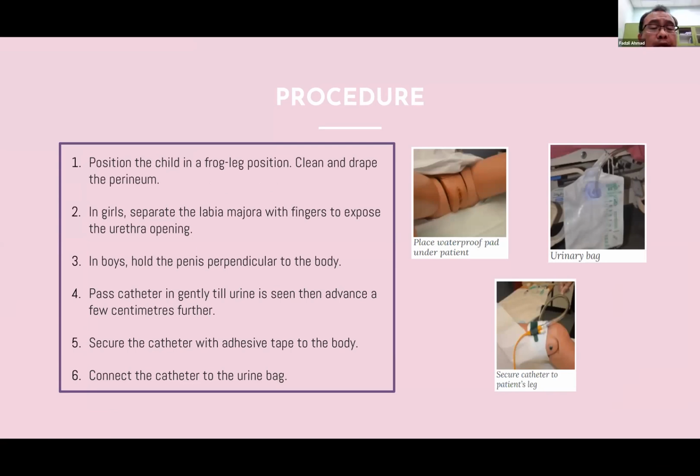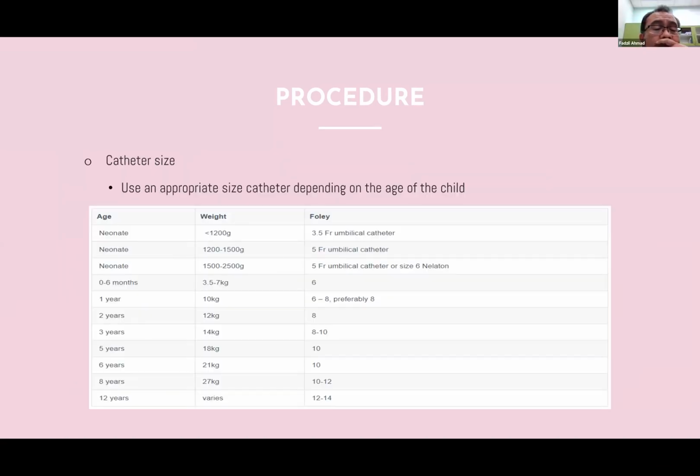Sebelah belakang tadi boleh? Reference umbilical catheter. Yeah. Okay. Okay.